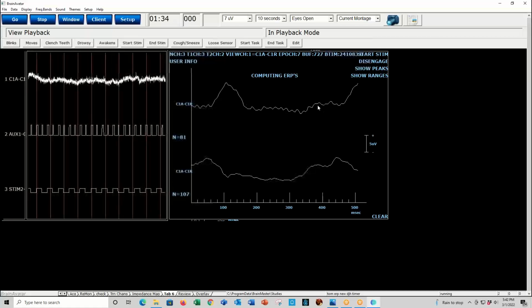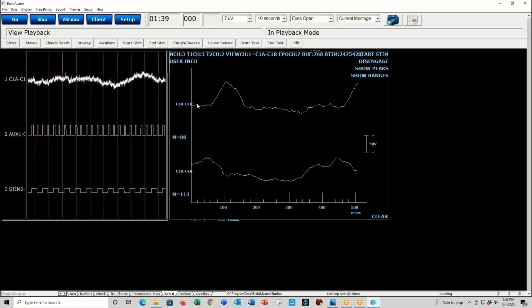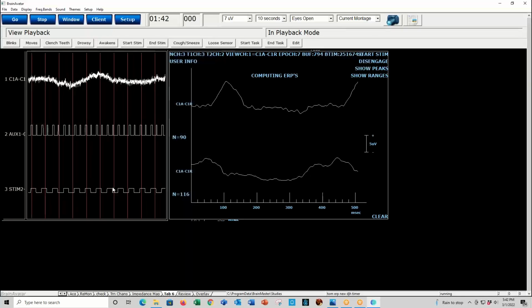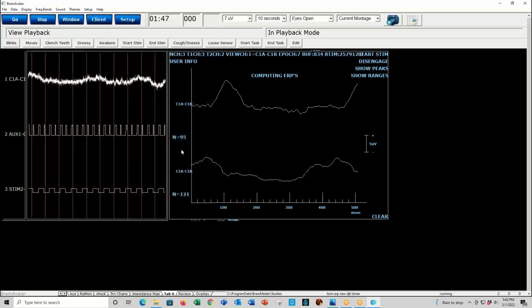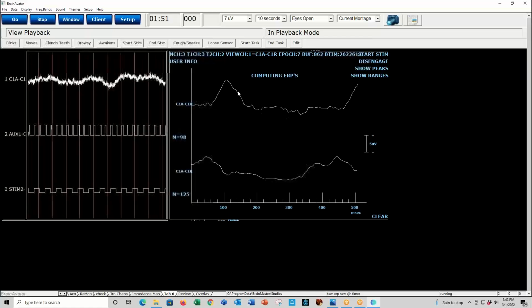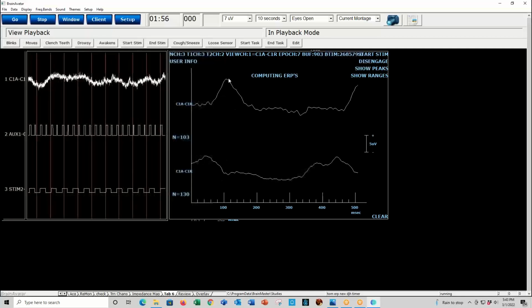And you can see, since it's a 400 millisecond period, at the 400 millisecond mark, another response is occurring. So this is really the steady state response to a checkerboard using 400 millisecond period. And now we have 94 averages, and we can again see the clear appearance of that P100 at 100 milliseconds.